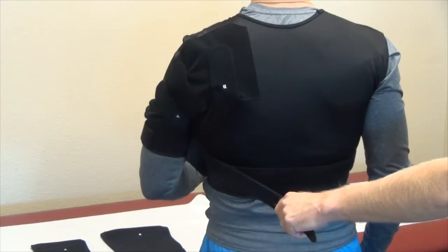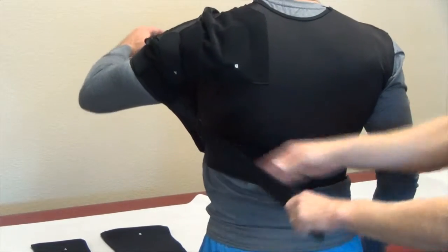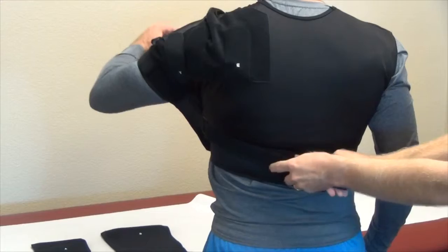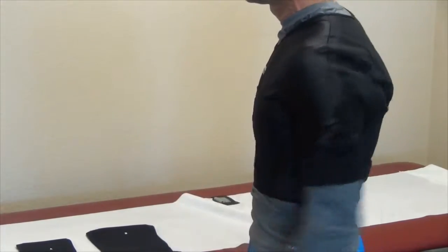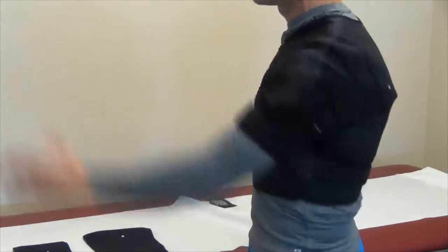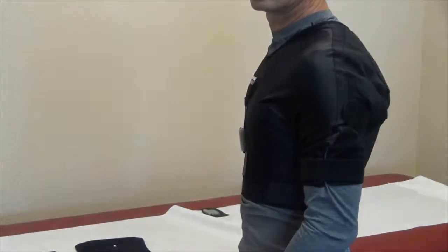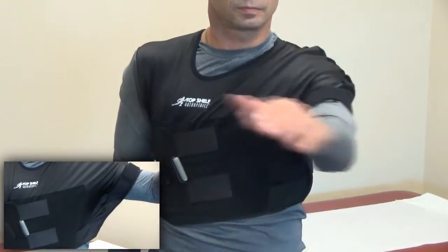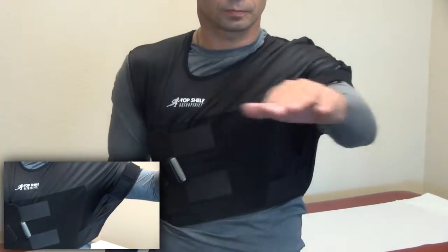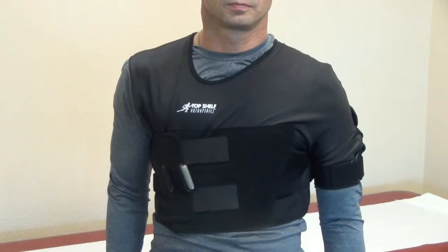Secure the back strap to assist with abduction control. The back strap in conjunction with the axillary webbing will prevent the arm from being raised beyond 90 degrees. Notice the control of abduction as well as forward flexion across the chest with the application of the garment only.